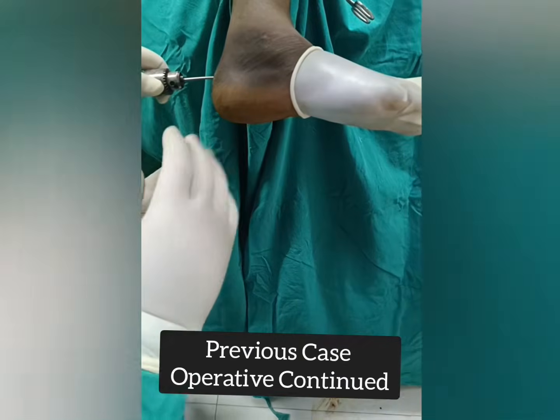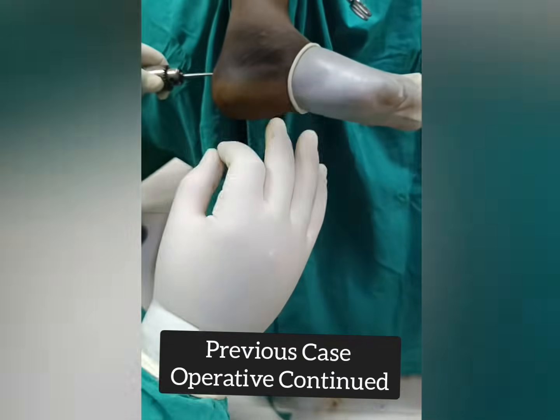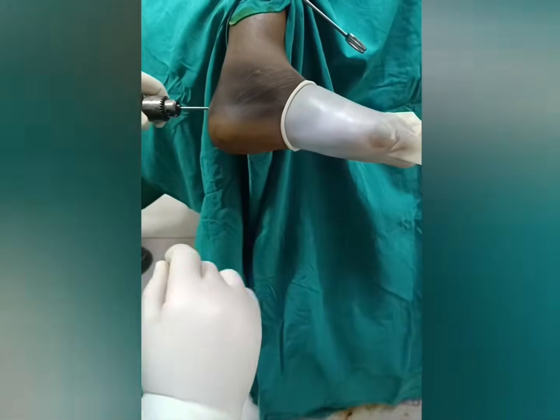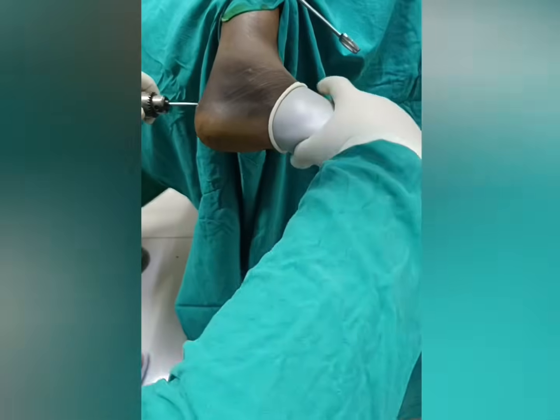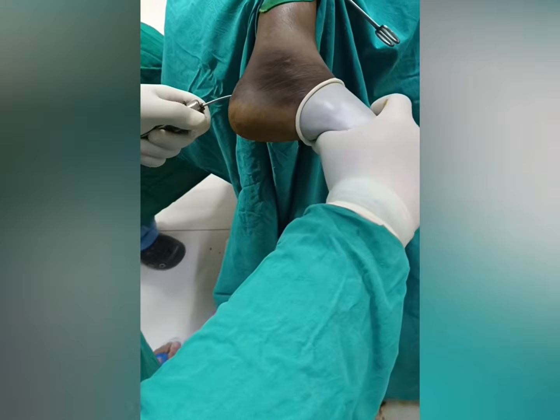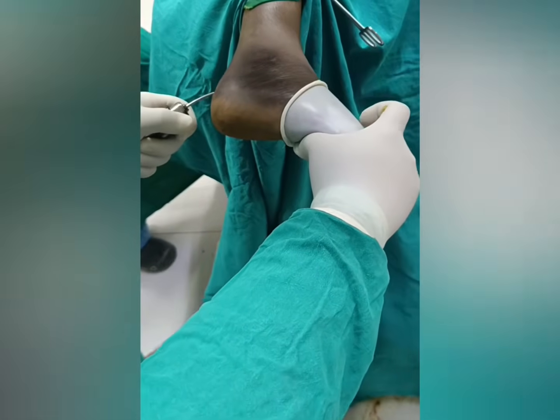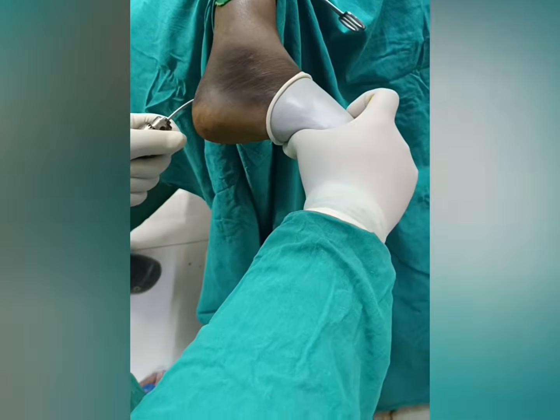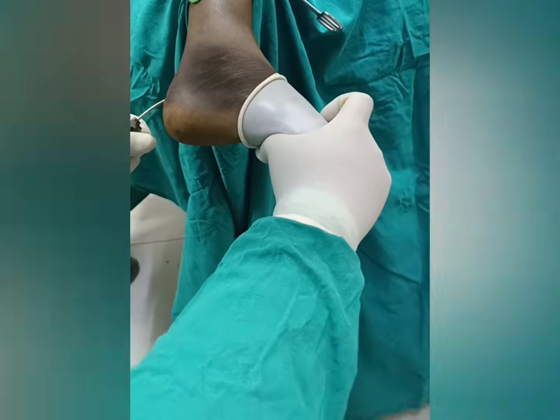Calcaneal tuberosity. Okay, now we want to correct the Bohler's angle, Gissane angle, and the articular talocalcaneal margin. Okay, so we will plantar flex the foot, holding the front of the foot with one hand, and we will step in like this for the reduction maneuver. This is the reduction maneuver.